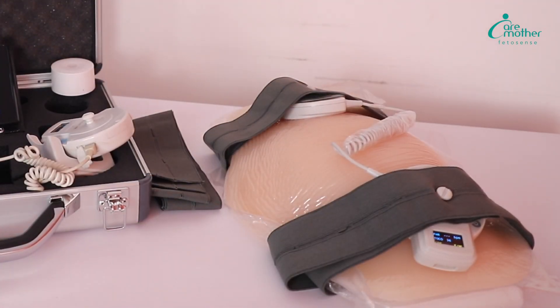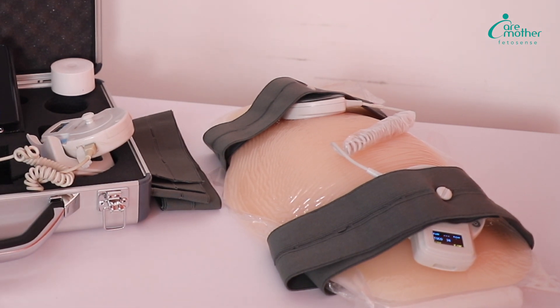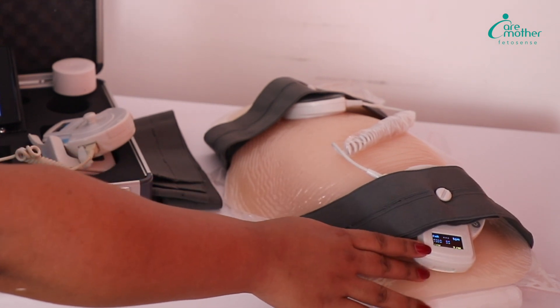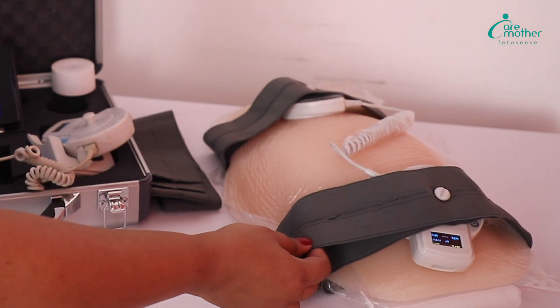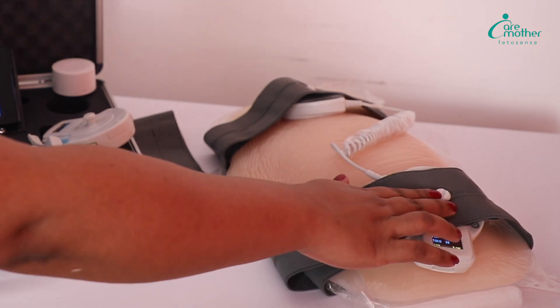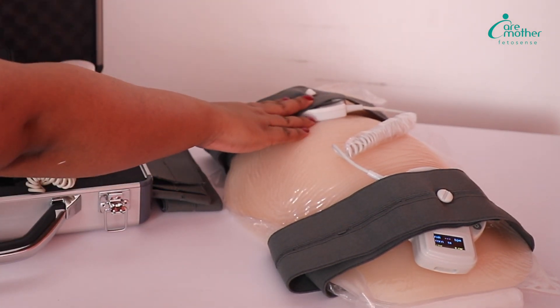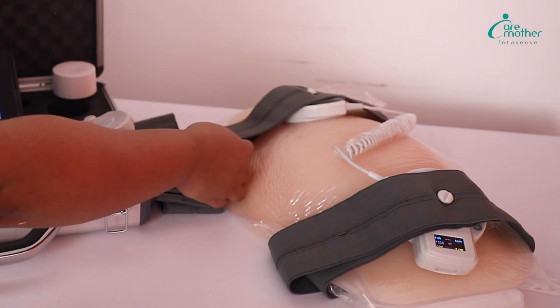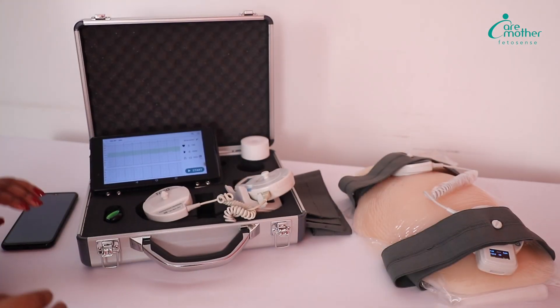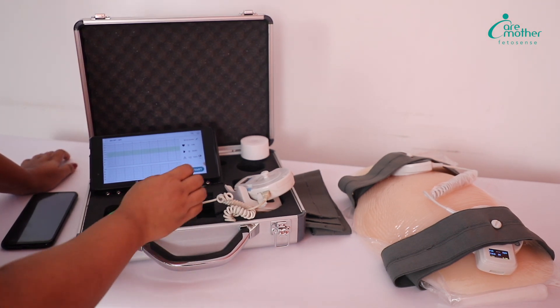Before starting the test, let me show you how to place the Dopplers on the mother's belly. The FHR probe is placed at the lower side of the belly and strapped using the belt looped onto the hook. The TOCO probe is placed on the upper side of the belly and similarly strapped. After strapping is done and the movement marker is given to the mother, we will start the test.